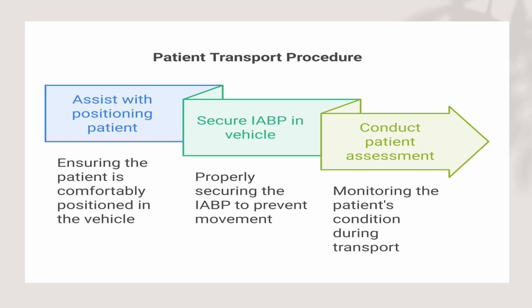A full patient assessment should be done by monitoring the patient's condition: first vital signs, blood pressure, and heart rate, every detail. See the arterial pressure waveform to check the timing and optimal diastolic augmentation. Assess the patient regarding rhythm, urine output, and peripheral perfusion of the pedal pulse. And we should ensure that the gas alarm is enabled all the time, and our eyes should be on the screen if we can't hear the sound of the alarm.